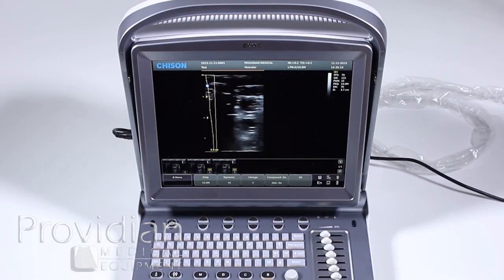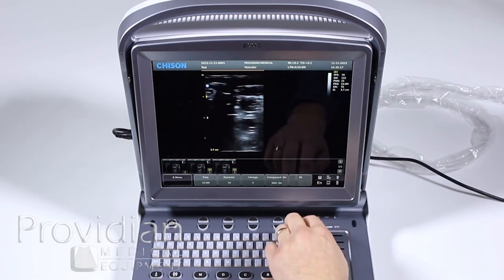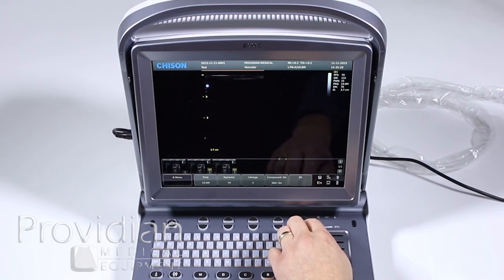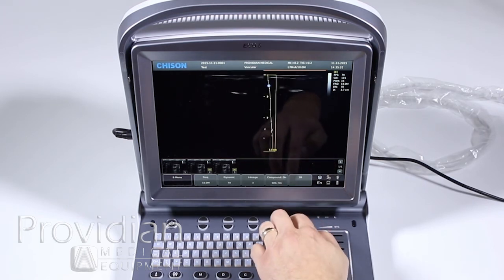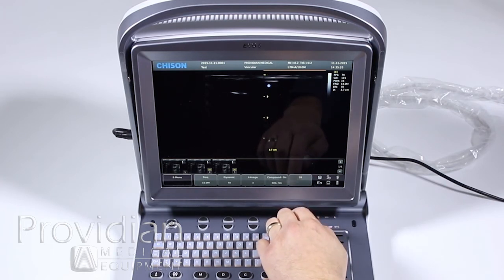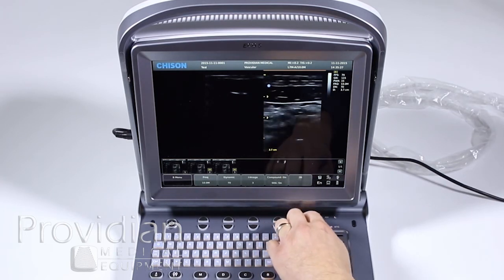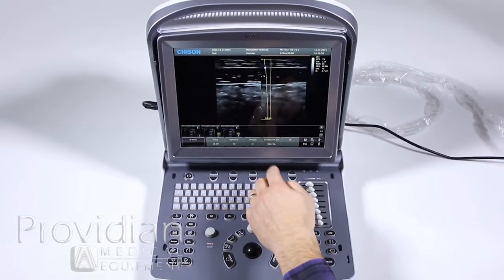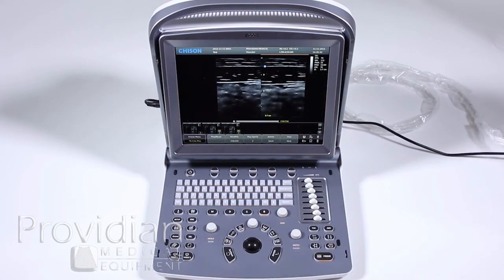The 2B option gives you a split-screen image. To switch between the two views, hit 2B to pull up a second image. Each side will be live, and you can switch back and forth between them, then freeze both images.